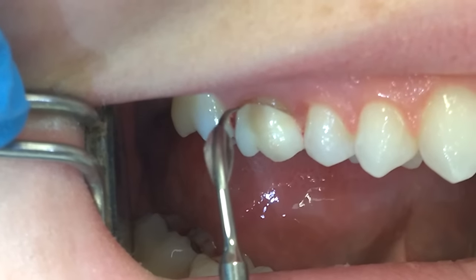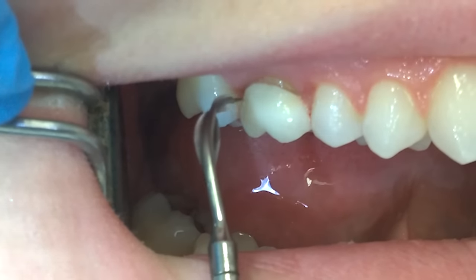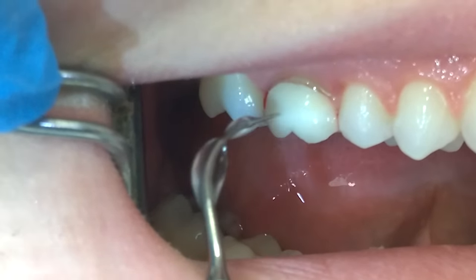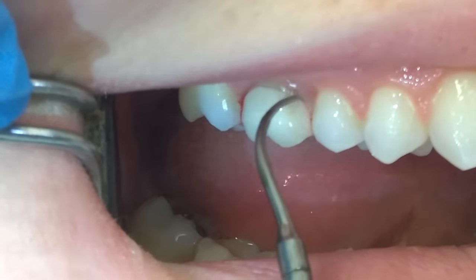If I see a lot of bleeding around a crown, I'll use a power-driven scaler to flush out the gingiva. You want to avoid placing the ultrasonic tip directly on the crown material itself, whether it's silver or gold or porcelain.